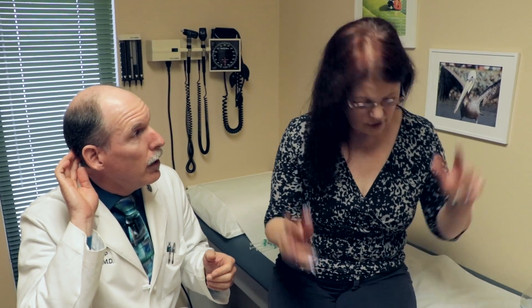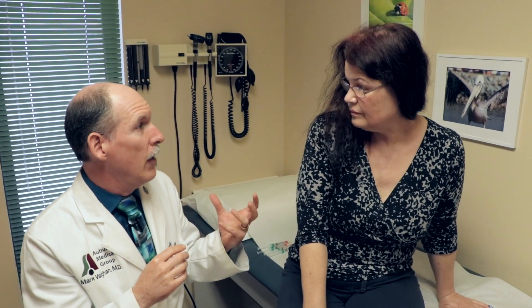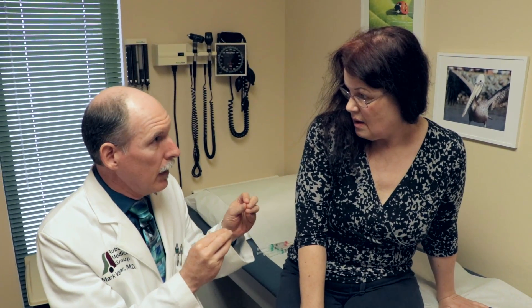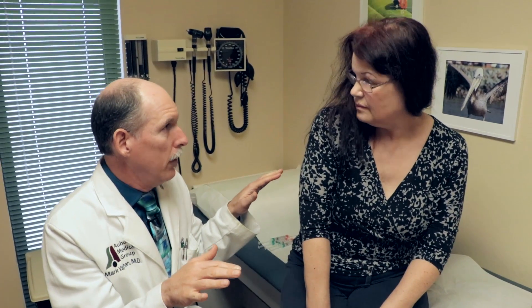We're going to use a technique of nerve block on the greater and lesser occipital nerves where they come out in the back of the skull — two injections on each side. The purpose is to block those nerves that serve sensation not only for the outside of the skull but even on the inside where you're actually feeling the pain of the headache. This will most often totally break a migraine.